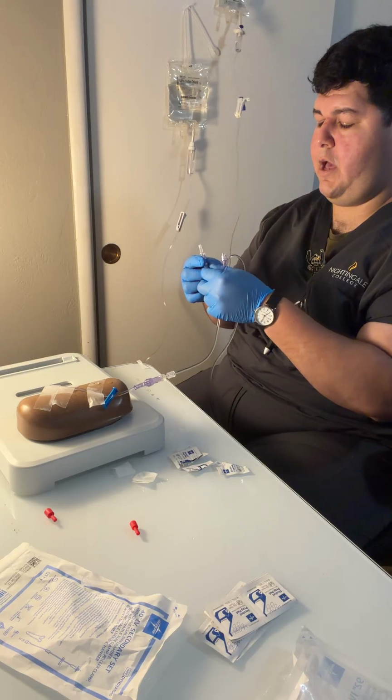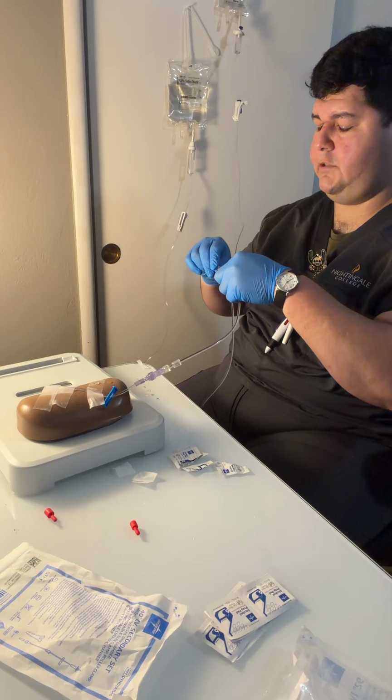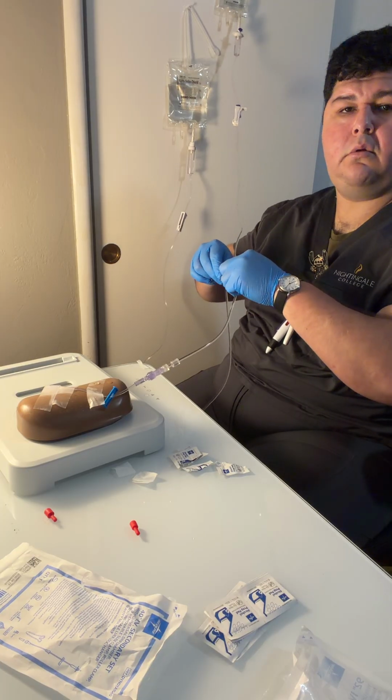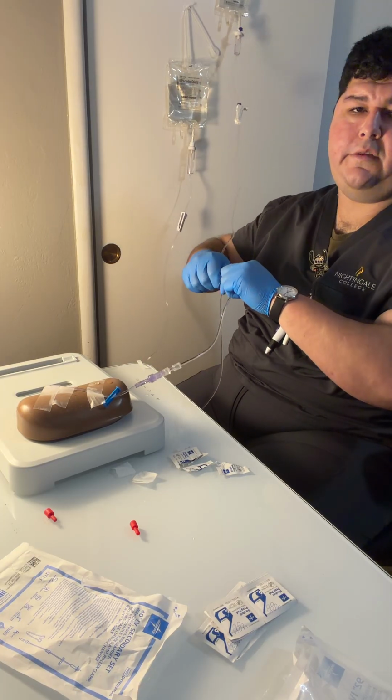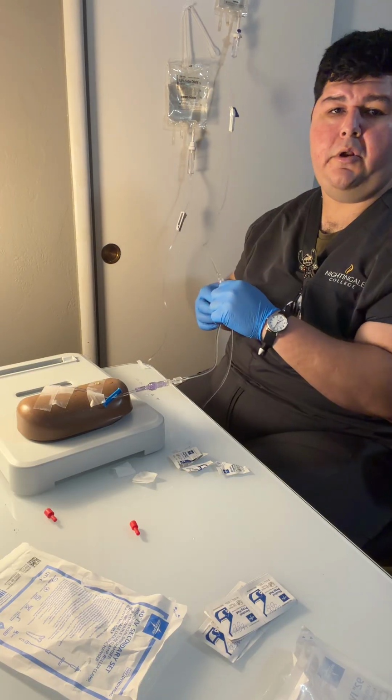We're going to remove the caps and then attach it. And then we're going to attach our secondary tubing to our primary tubing like such. Then we're going to go back to our clamp.